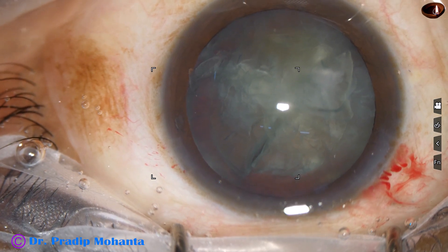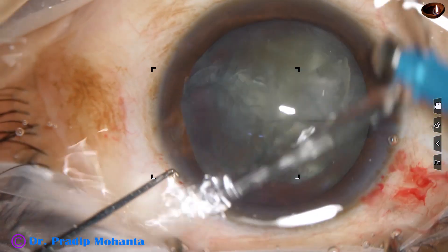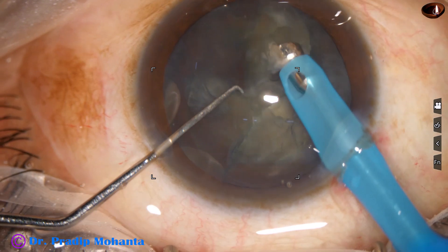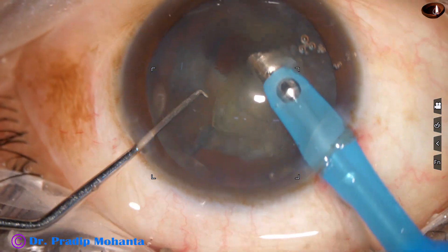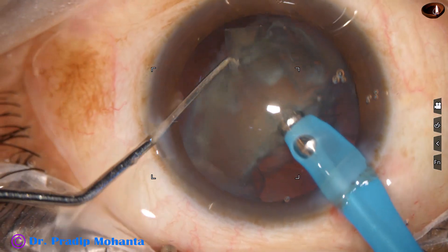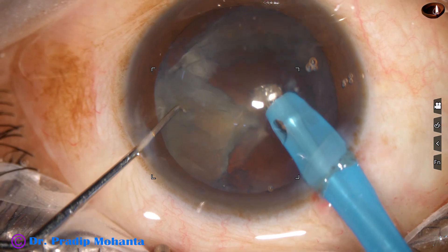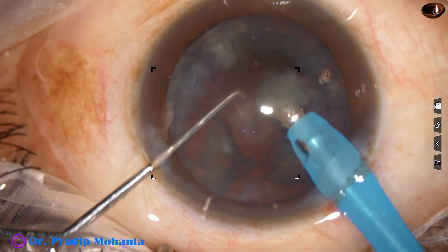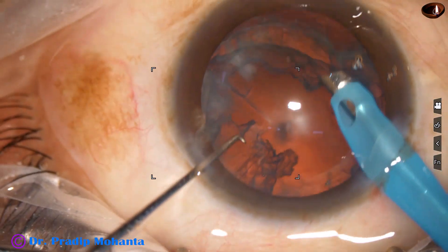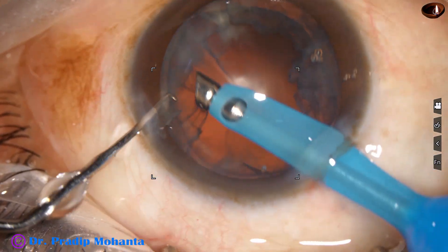The nucleus has been divided into three pieces. One heminucleus has been divided into two pieces; the other heminucleus has not been divided. Now the phaco tip goes in and picks up one fragment and it is emulsified. Another fragment is picked up. The heminucleus is held gently with very little vacuum and it is chopped. This is the last fragment. Ultrasonic energy used in this case is 50%, flow rate is 45 ml per minute, vacuum is 450 mmHg. The epinucleus is being removed at this moment.